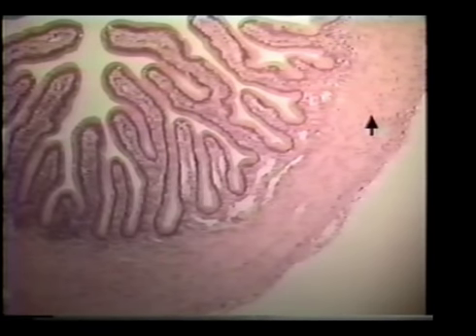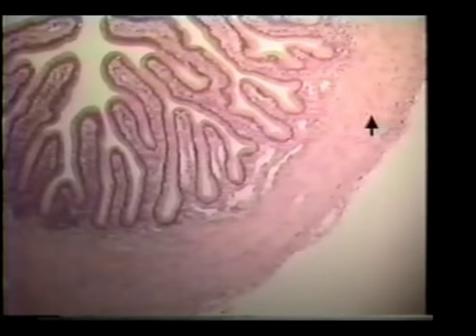Now, some of you may be asked to identify smooth muscle in the wall of the urinary bladder. That will be from the same slide that you looked at for stratified transitional epithelium. But this slide is a wall of the intestine. So we're going to zoom in on this outer wall here. We're really only going to see a sort of streaky appearance to this. That's why we have the other slide, so that you can see individual fibers.